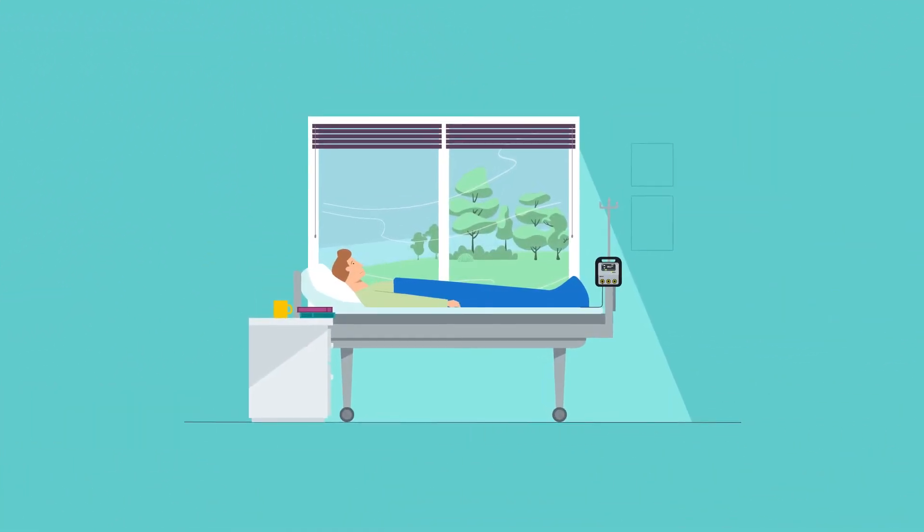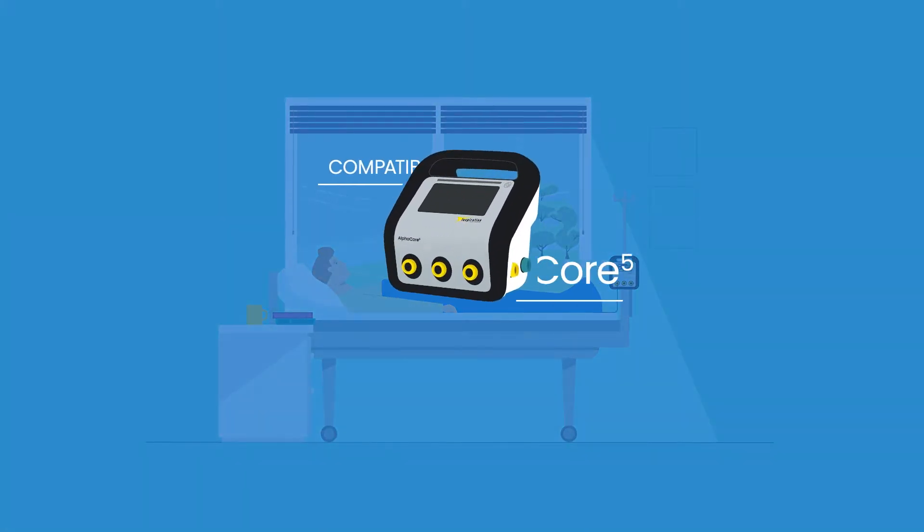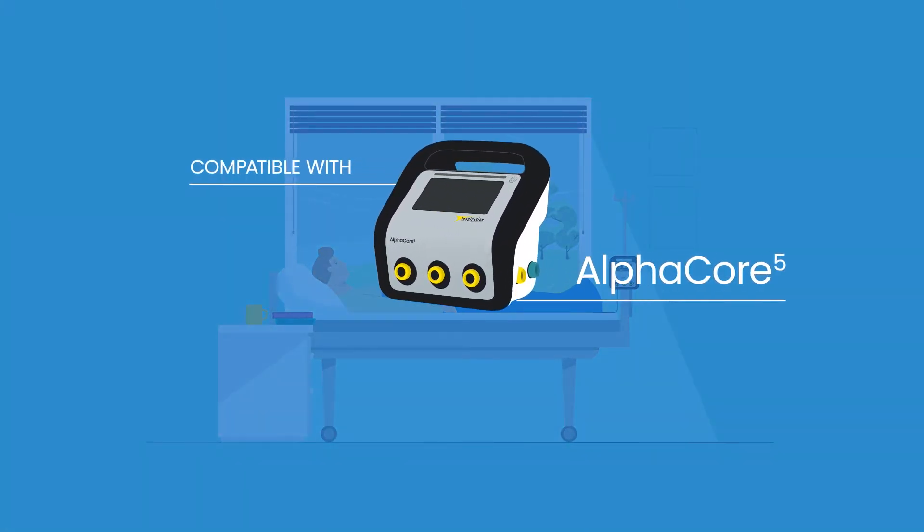RB1 is designed to maintain patient temperature in the pre and post-operative theatre setting and is compatible with the AlphaCore V controller.